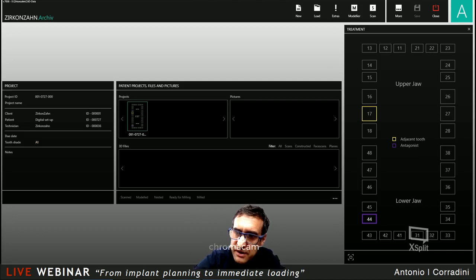So with face hunter and face scanner, everything is becoming much more, let's say, much more easy. The possibility to use the face scan related to the models, to put the anatomy in the right place, that's absolutely something interesting and helpful in our daily jobs.